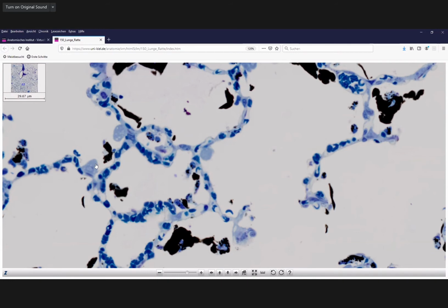They are progenitor cells. So exactly, they differentiate to the type 1 cells. They are the progenitor cells, and they can proliferate once in a while, and a daughter cell can develop into a type 1 cell. So they help to replace the epithelium regularly, which now lines the surface of these alveoli.